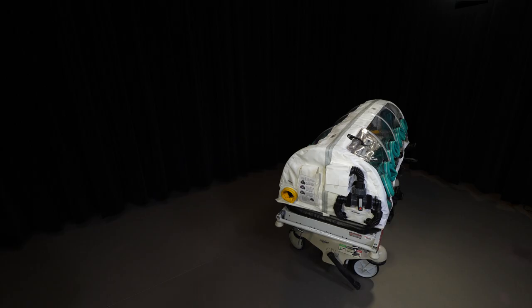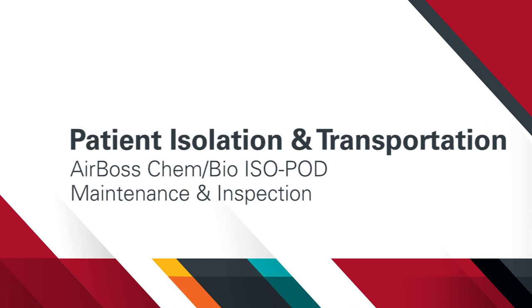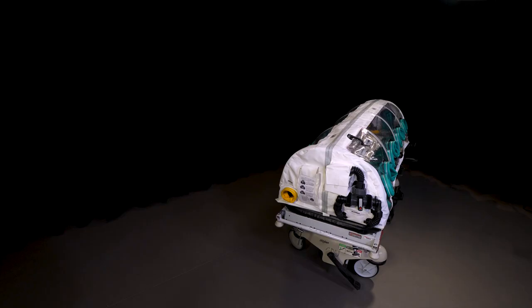In this video, we discuss the specifications, components, and general maintenance inspection routine for an AirBoss ChemBio isopod. Operating in its negative pressure mode, the AirBoss ChemBio isopod was designed for safely transporting a patient with a highly consequential pathogen of concern or chemical agent. Other versions of this isolation device are manufactured by this company, and a large proportion of this video is also applicable to those devices.